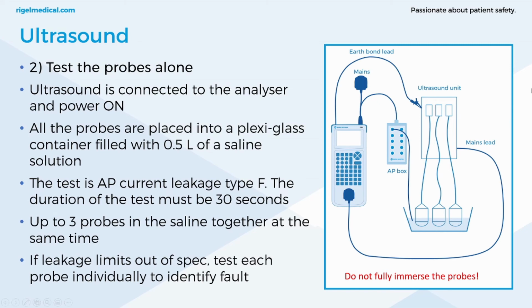If we imagine that perhaps one of these casings or the actual transducer crystal itself has become cracked, then we can assume that gel can get into the ingress and then it becomes part of the circuit, and you've got potential of electric shock to the patient. So we're assuming all worst eventualities. What we're doing with saline is just simulating that condition, replicating what the ultrasound gel is doing, and it's very effective.